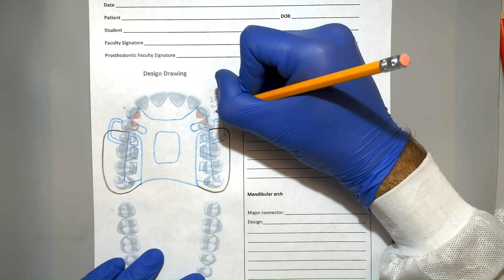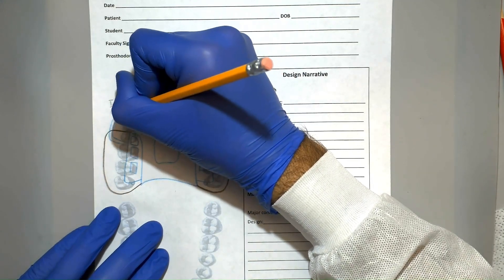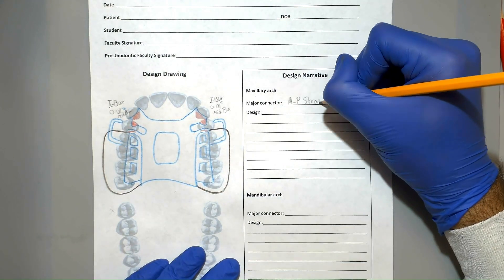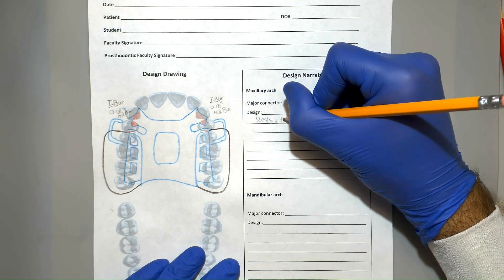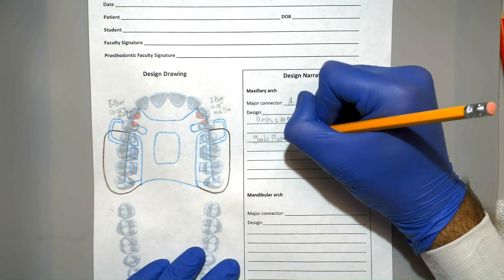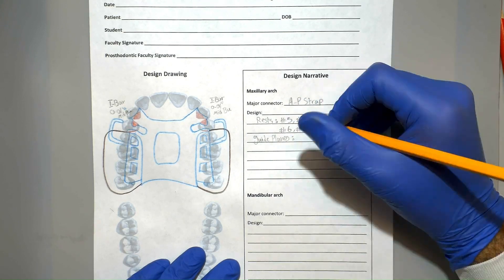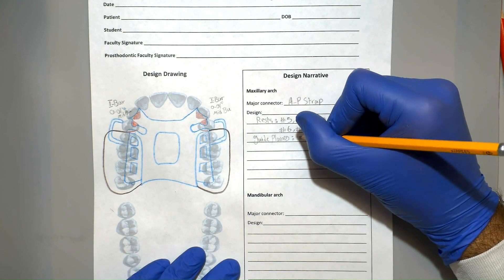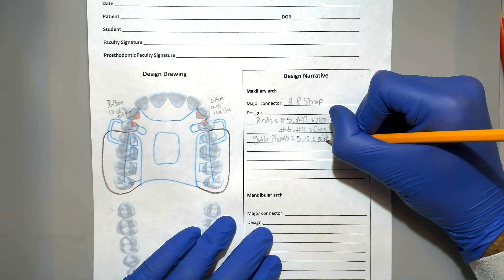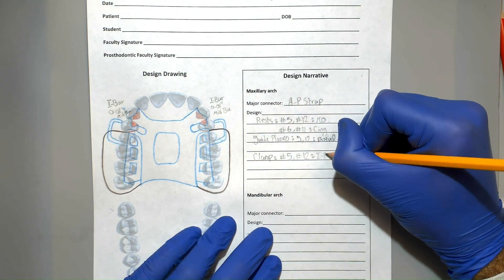We're almost done with the drawing. The only thing left is to write up some information about each clasp next to its drawing. This includes the name of the clasp and the undercut that it's engaging. It's sometimes recommended to add a little more narrative including the type of major connector, the rests, guide planes, as well as clasps.